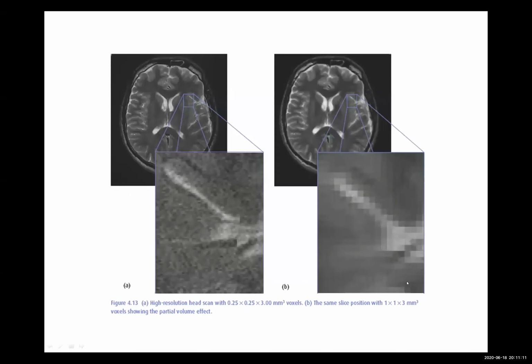So this first picture is taken from a camera with a very low resolution, and it was a very small object in that field. And then we wanted to see what that object is, so we magnified it until this is the maximum we can see. But if we have an advanced camera, we will be able to zoom until we see all these details.